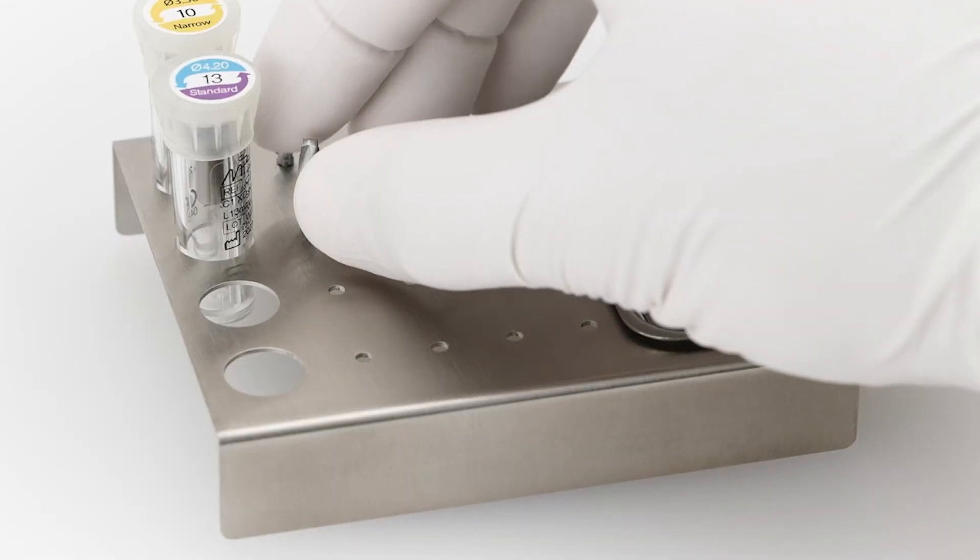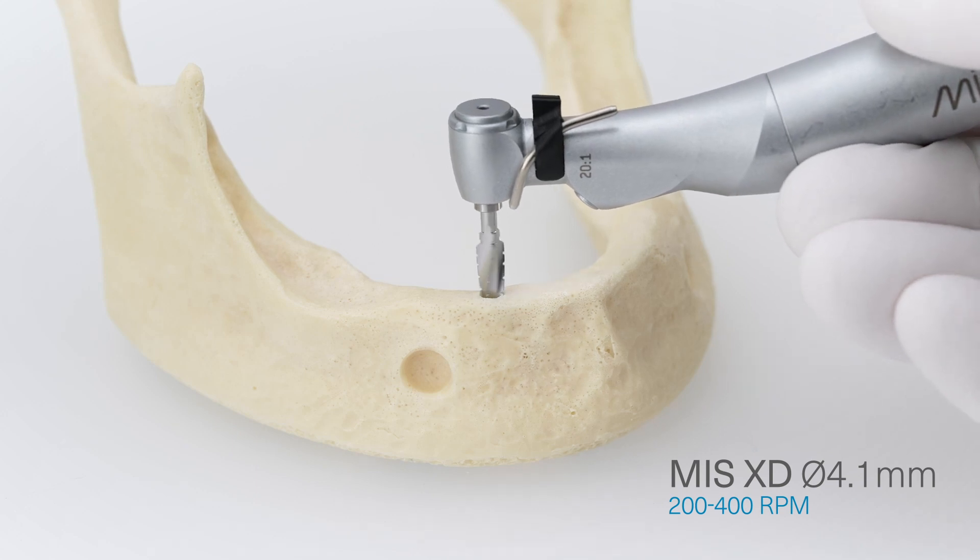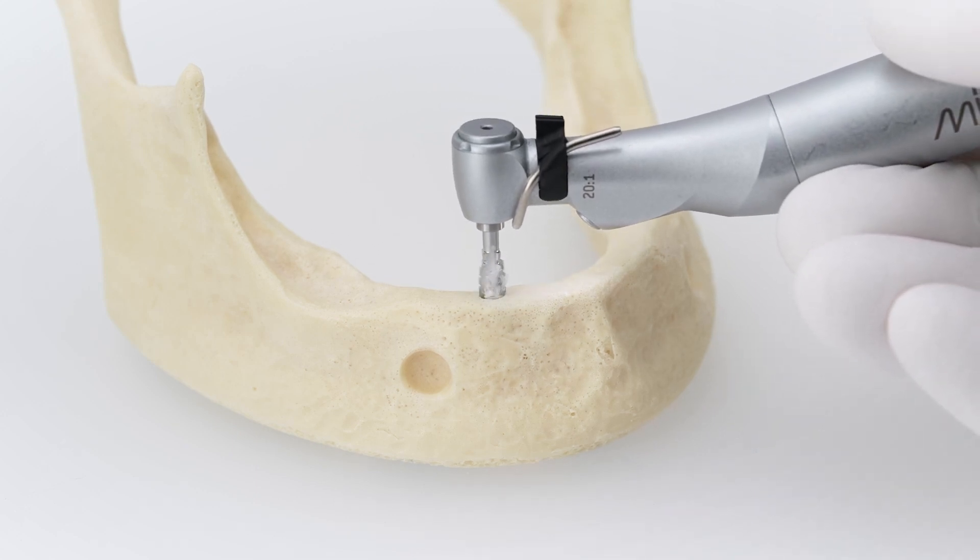Next, use the XD 4.1 diameter procedure drill. This drill is the last drill of the sequence and is compatible with the implant shape and dimensions.